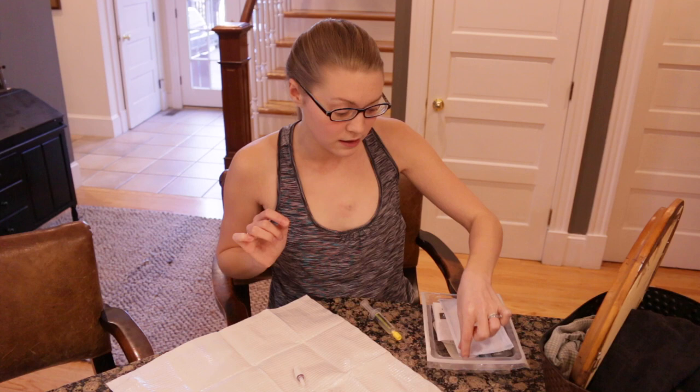I don't remember if I've always worn a mask, but it's a good idea. I'll leave it up to you and your care team whether you need to wear a mask or not. I'm going to skip it today mostly because I'm pretty sure it's going to block my view and makes it hard to breathe, so I'm just going to put that to the side.